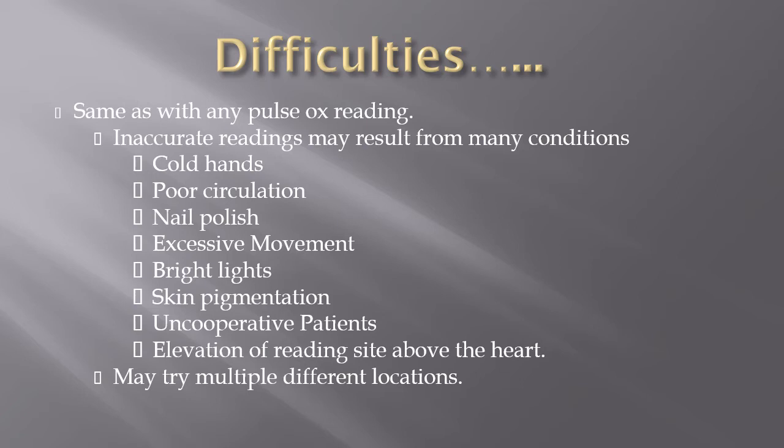The best practice is to have tissue pass through the sensors versus reflected off of bone, such as placing it on the patient's forehead. Keep in mind that if the finger probe is not working, we have alternate pulse ox sensors, such as the pediatric sensors and the rainbow sticky sensors, that will help you get a better reading.